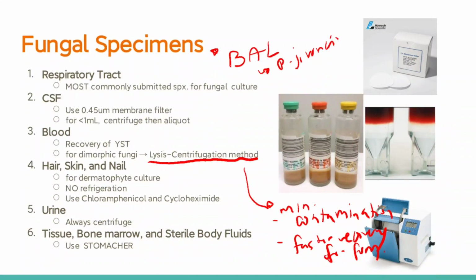Okay? Next, we have the hair, skin, and nail. This is specifically for dermatophyte culture. So, no refrigeration is required for these specimens. And then you need to always use chloramphenicol and cycloheximide. So, what is the purpose of those? Chloramphenicol is an antibiotic to inhibit bacteria, whereas cycloheximide is an antifungal. Its purpose is to inhibit saprophytes.